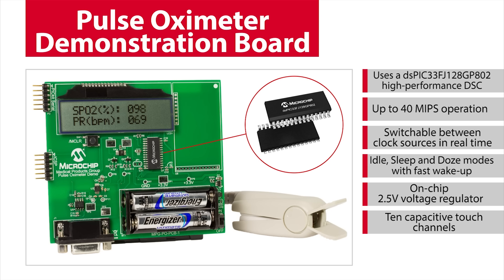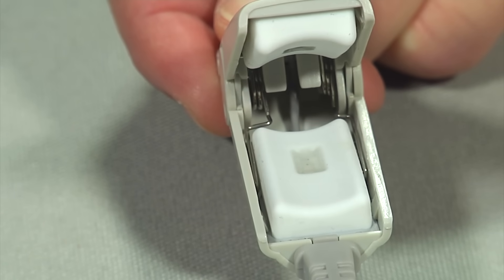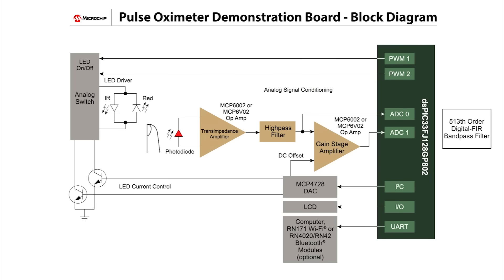So let's take a closer look at the features of this demo. The red and infrared LEDs in a standard medical probe are alternately turned on and off to transmit light through the user's finger. A photodiode in the probe receives the transmitted light, and this signal is fed through Microchip analog parts used for signal conditioning, and then to the DSPIC33's internal 12-bit ADC. The output of the ADC is then filtered in firmware by the DSPIC33 DSC. Using Microchip's free digital filter design tool, a 513th order digital FIR bandpass filter was implemented in the DSPIC33's firmware and used for this demo board.